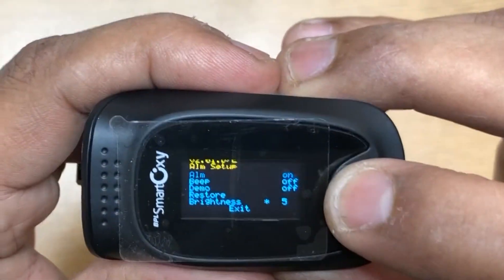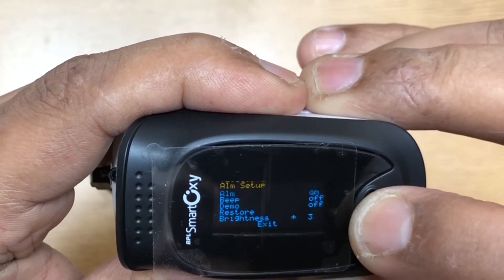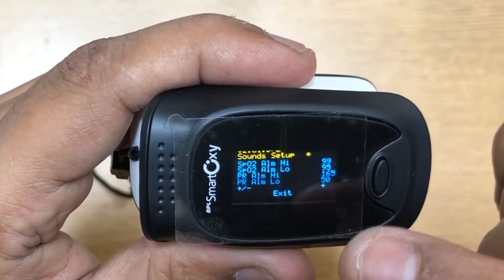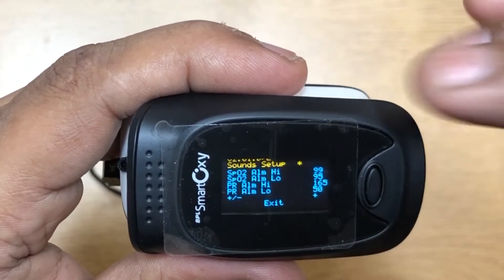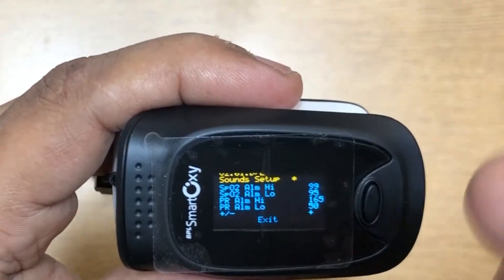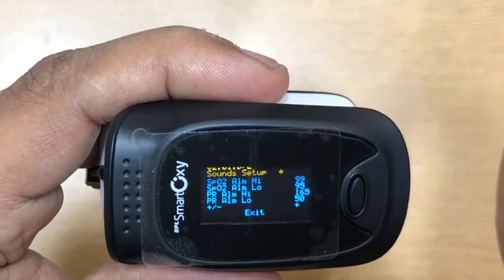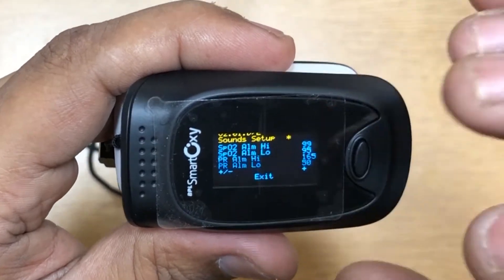Let me show you the brightness — this is the brightest at level five, and it goes down to one, two, three, four, five. That's the brightness setting. In sound setup you have the option to set the high and low values for oxygen and heart rate. For example, you set a high value of 99 and a low value of 95 — that's the preset, but you can change it. If your oxygen level goes above or below that range, it will start beeping.